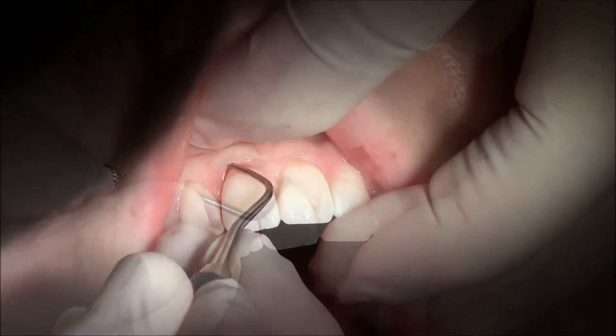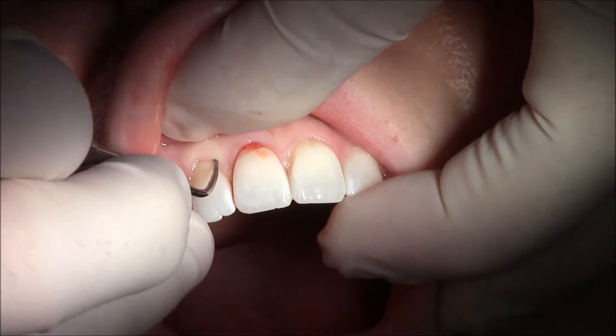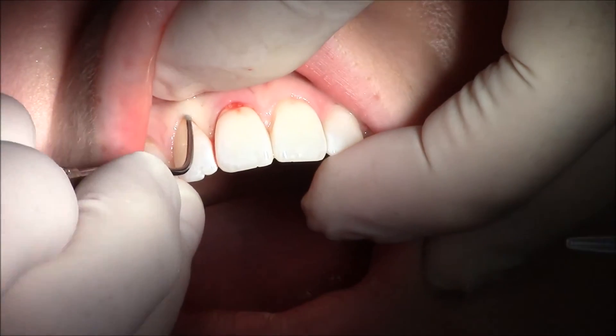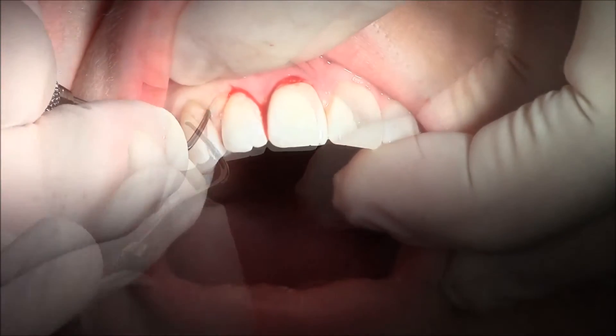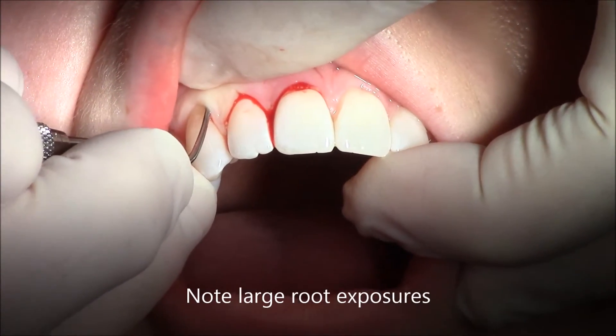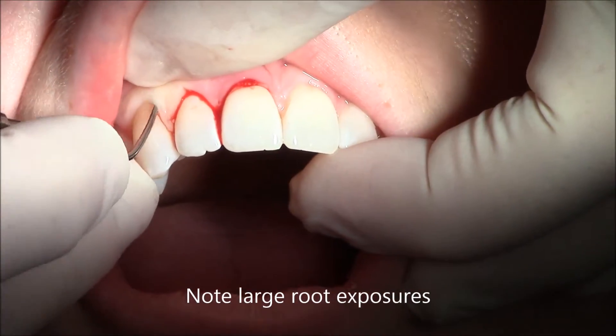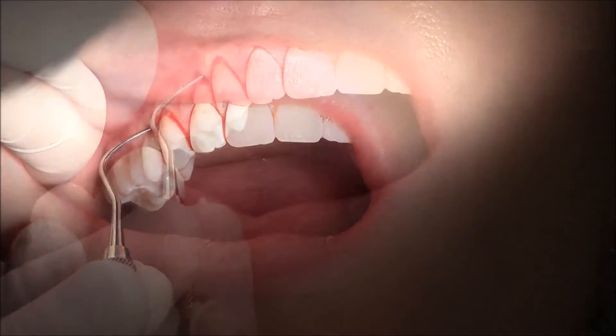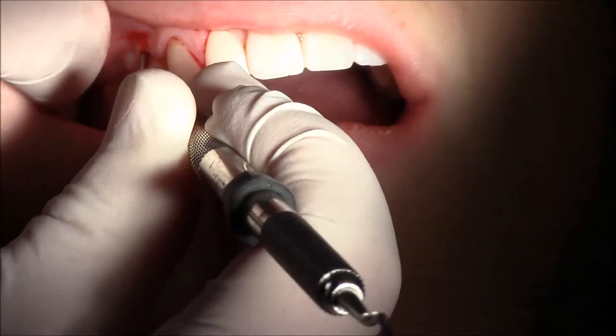Now there's about a millimeter of recession on this young patient on both the incisors. The canine has 2 to 3 millimeters of recession and there's 3 plus millimeters of recession on the premolars that we're treating. So we loosen up the tissue and cleanse it with sterile saline that you see coming in and rinsing.